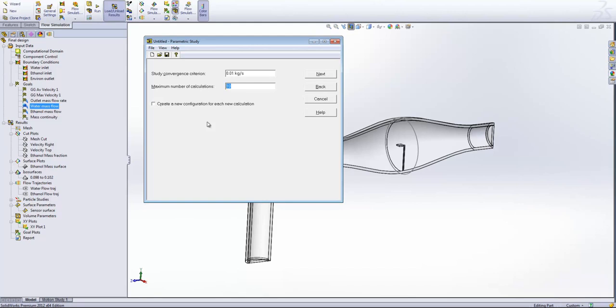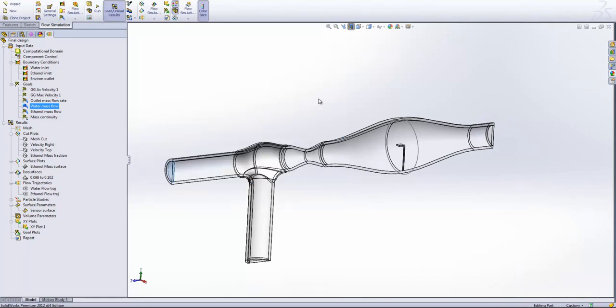And we can specify the number of attempts it has. So the system will carry on trying to refine your design, trying to change that dimension until we reach that value, or until we reach the maximum number of calculations or attempts. And then we can specify whether to generate a new configuration for each of those attempts or not. And then the system will just run through an optimization process and try and give you the best answer that you can get.